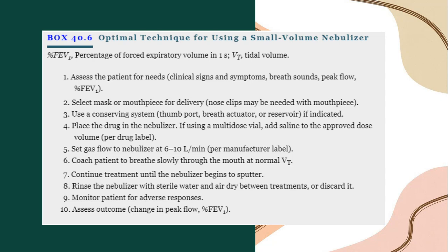Today, we're going to take a comprehensive look at aerosol drug therapy and the various nebulizer technologies involved. This slide ties together many of the concepts we've discussed so far, emphasizing how these therapies are applied in clinical practice. Aerosol drug therapy is a cornerstone in managing respiratory conditions, allowing us to deliver medication directly to the lungs for rapid and effective treatment.